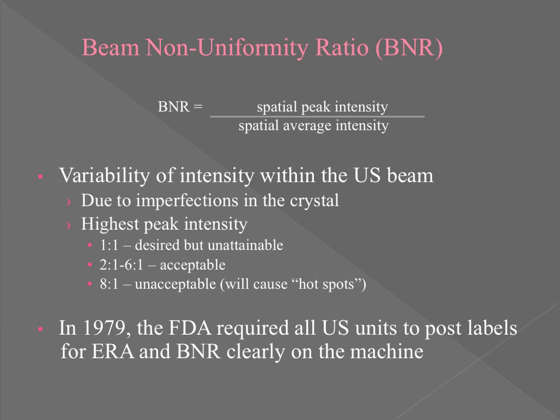Just think when your fiance, your hubby, your significant other buys you a wedding ring, or a band. What do we know about that crystal? It's not perfect. Even if you get VVS, it's still not perfect. It's flawed. The same thing happens with an ultrasonic crystal. It's flawed as well, which means since it's not a perfect crystal, we're going to have areas where there are high ultrasonic intensities and low ultrasonic intensities, right?